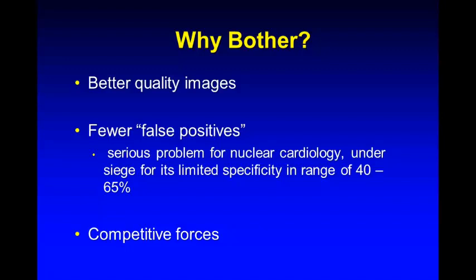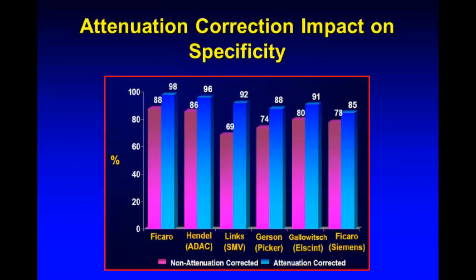And there has been some recent CT literature and some biased samples where it shows that the nuclear specificity might be as low as 40% in a recent JACC paper from the ACIC registry. And there are some people who are taking this against our field and trying to sell other imaging modalities, whether without radiation or with radiation, to compete for this kind of test, which is probably the most ordered test so far to rule out coronary disease.